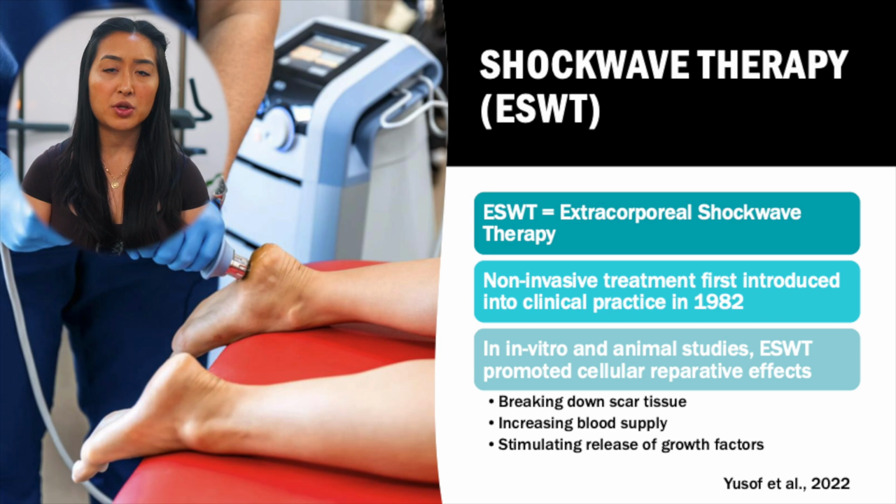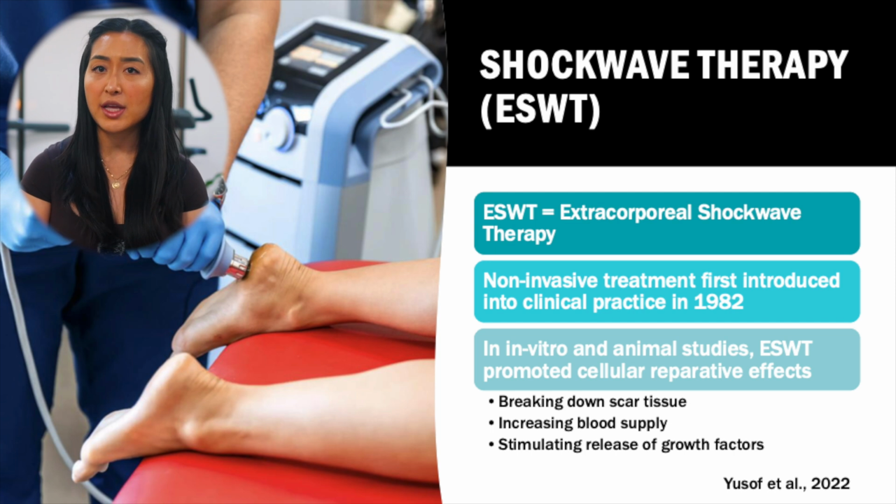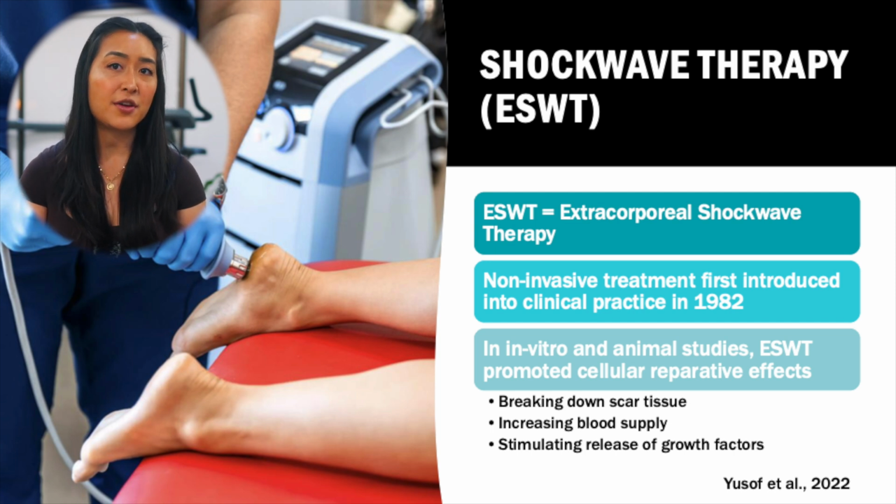In earlier in vitro and animal studies, shockwave therapy was seen to promote cellular reparative effects by breaking down scar tissue, increasing blood supply, and stimulating the release of growth factors. And it was through these earlier studies that more research has gone into developing shockwave therapy as the shockwave that we use in physical therapy today for different types of lower extremity pathologies.